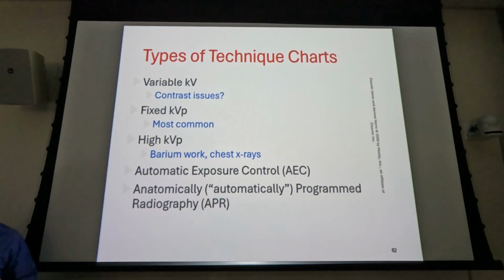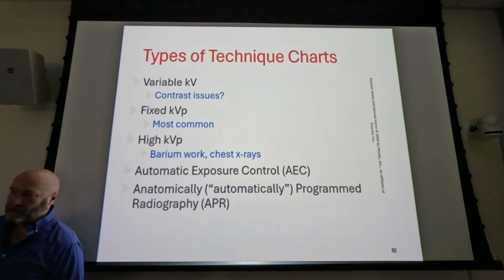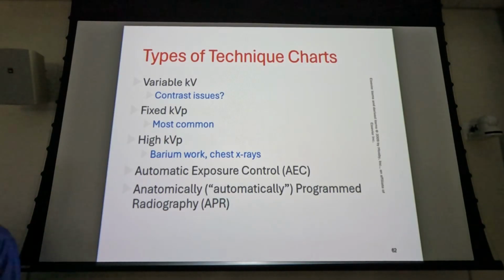So you're phototiming, and there's your key, what's going to happen? It's just going to be a longer exposure. Longer exposure giving you a higher overall mAs, right? So with a variable kVp, what you have is a relatively fixed mAs value. With fixed kVp, the mAs fluctuates.